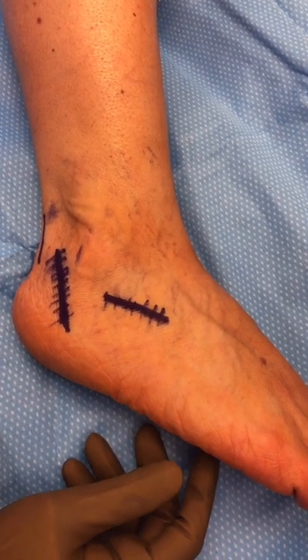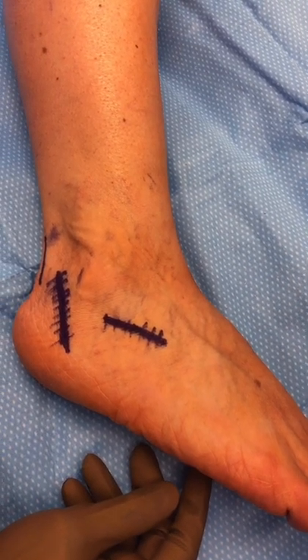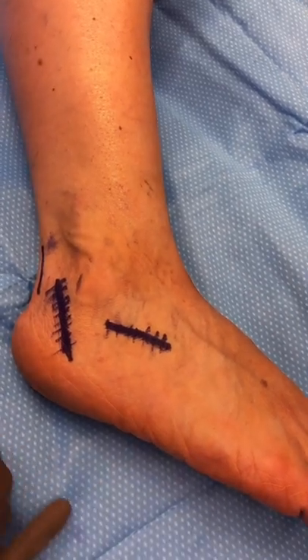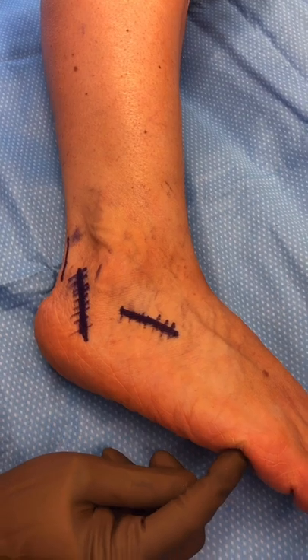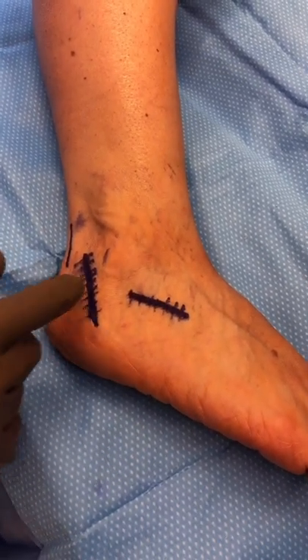When conservative treatments such as bracing, anti-inflammatories, arch supports, and correct shoes aren't working, we do a reconstructive procedure where we not only remove the diseased tendon and replace it, but we also cut the heel bone in two places and realign these two bones to shift the foot and build an arch.